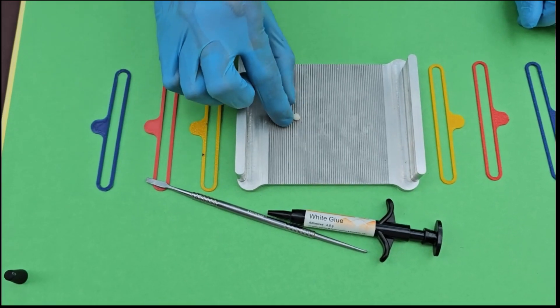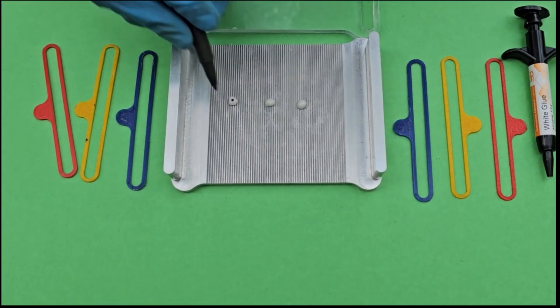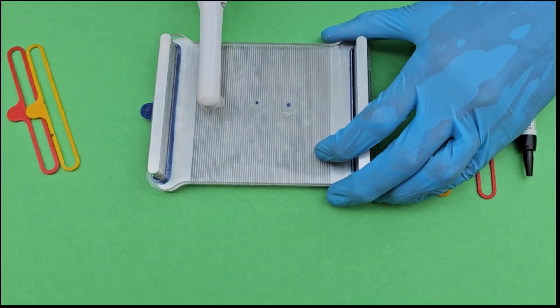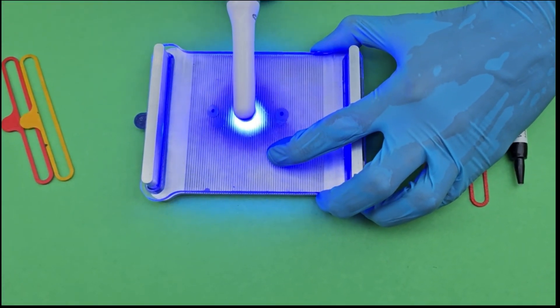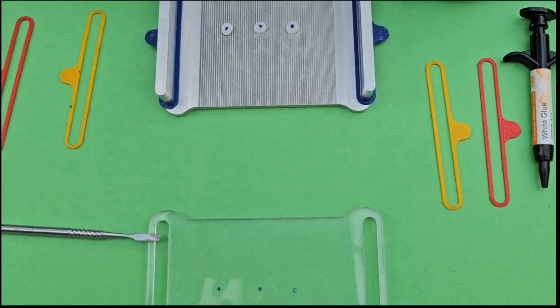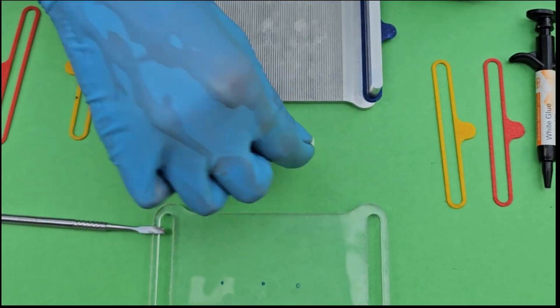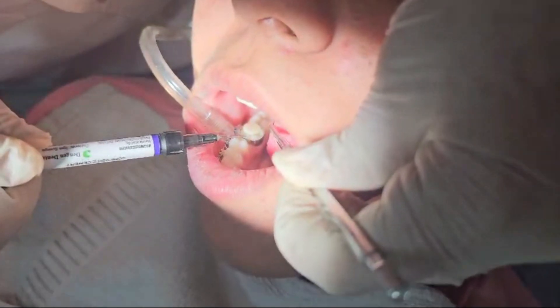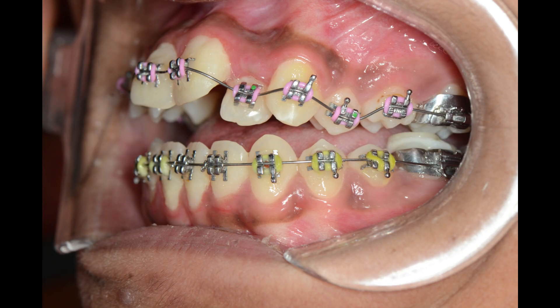We used our innovative Bite Maker to make bites which are smooth on the upper surface and serrated on the occlusal surface where they need to be bonded. We then bonded these two millimeter bite blocks on the molar teeth of the patient.